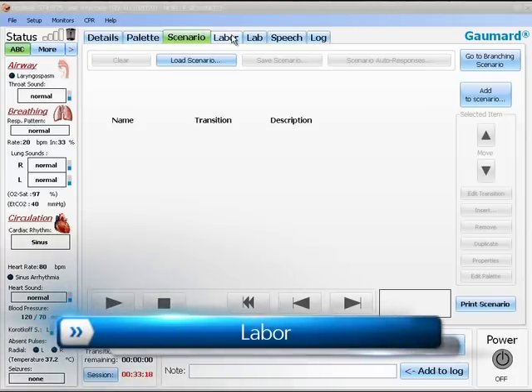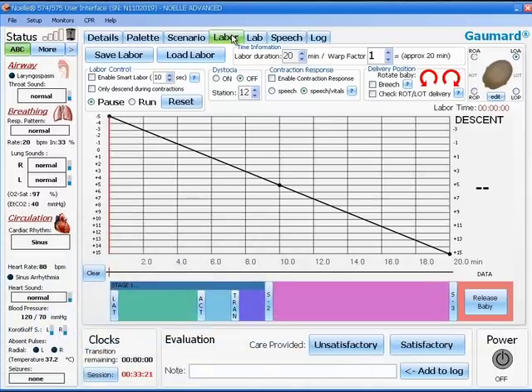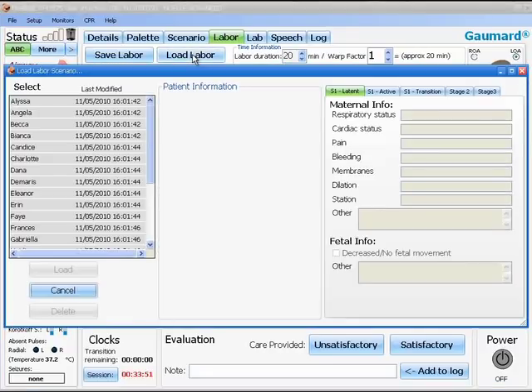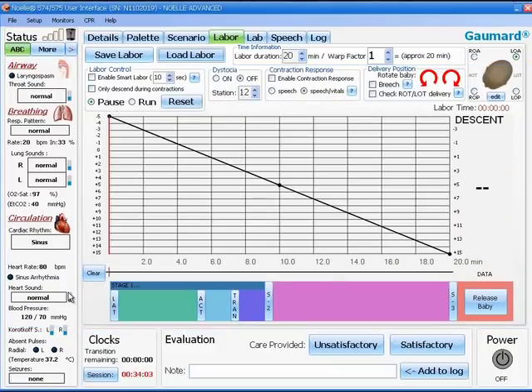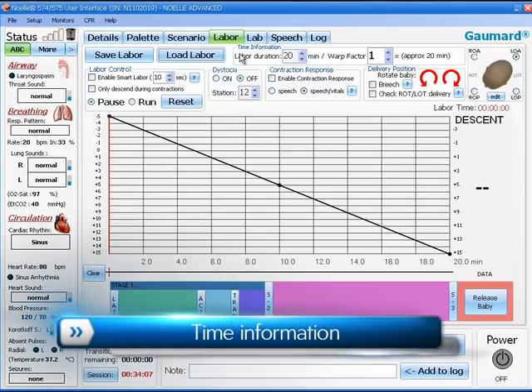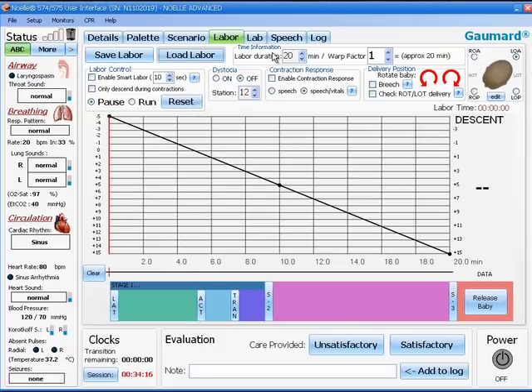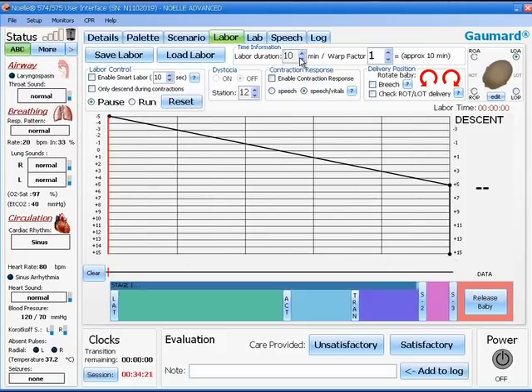Please click over to the labor tab. When the labor tab opens, you should see two large blue buttons in the top left. One says save labor, which I will skip for now, and the next says load labor. If you click load labor, a new window will appear showing you the preset scenarios. You may choose any one of these scenarios to load a preset labor. Moving over to the right, you will see a box labeled time information. Here you will set the duration of the labor, which can be anywhere from 5 minutes up to 120 minutes. For demonstration purposes, we will select 30 minutes.